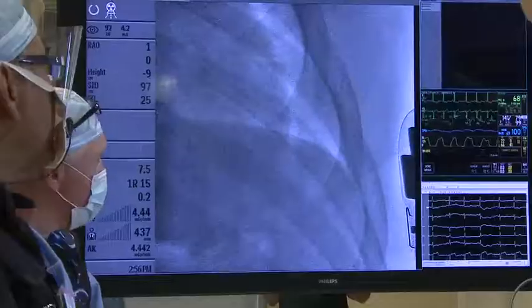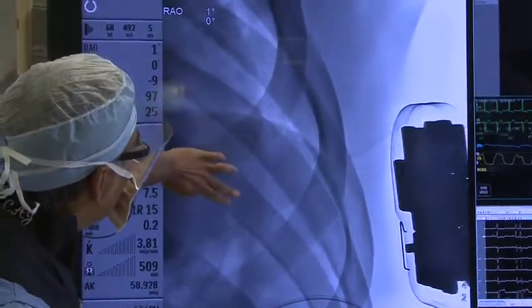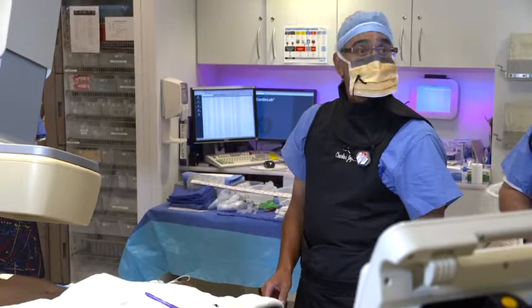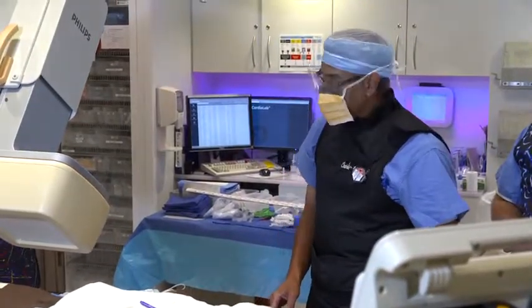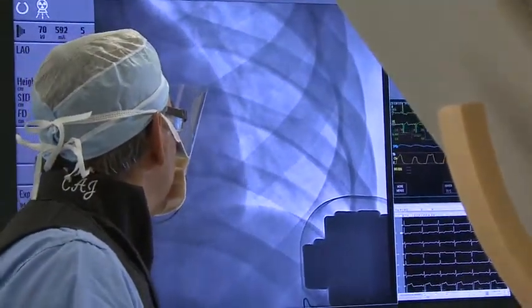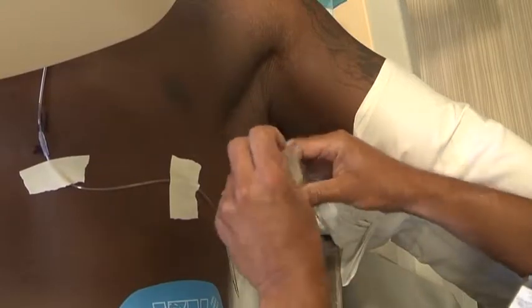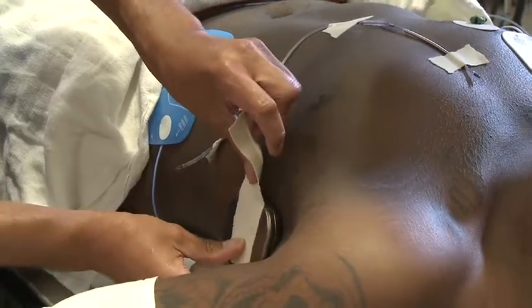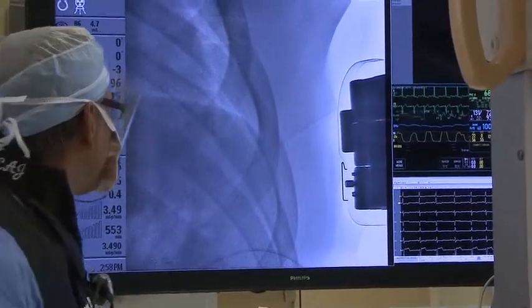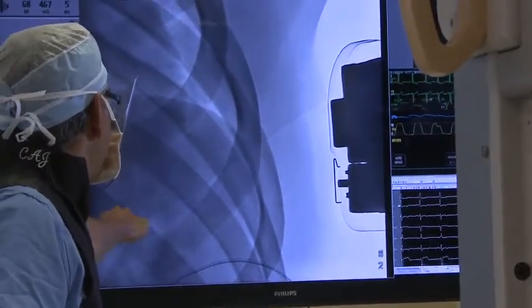You can see the can coming into the picture. The diaphragm is here, and you can see the border of the heart coming down. My opinion is the can is probably a little bit too low — I need to go up a bit. I'll also look at it in a left lateral, about 35 LAO, to get an idea of what we're working with. I think the can is a little bit low and needs to be a bit more posterior.